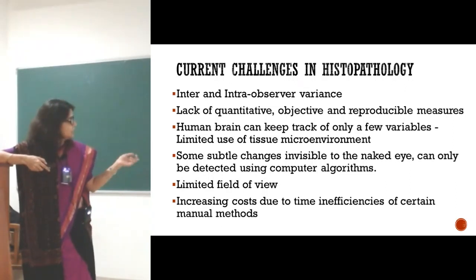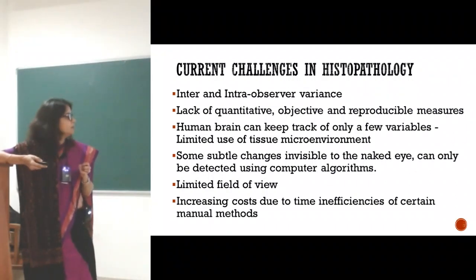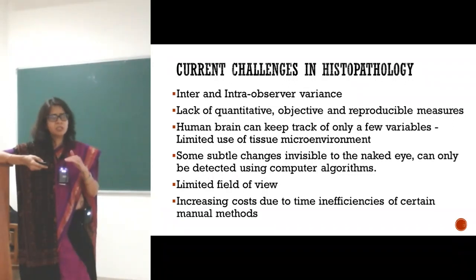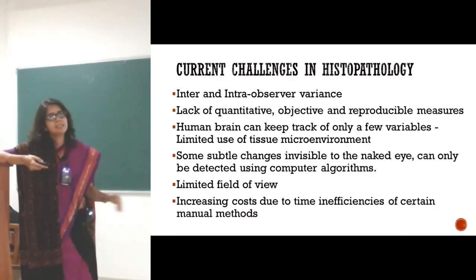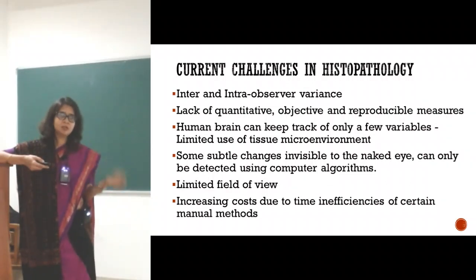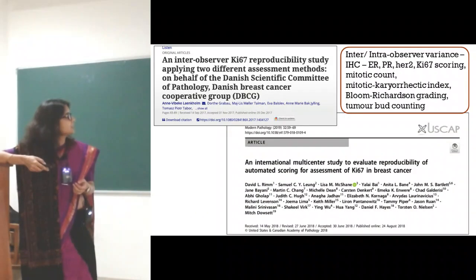And also, the last point: manpower costs are not cheap. For a histopathologist, a pathologist or a doctor to gain the expertise and the level of confidence to report all these details very accurately and very precisely takes years. They don't come cheap, and it takes a lot of time also. And we know that many hospitals are short-staffed, especially in the peripheral regions of the country. They don't have access to good doctors. So if we can do machine-based diagnosis or reporting in these areas, that can make a big difference and can save costs. So these are the challenges that we face currently.